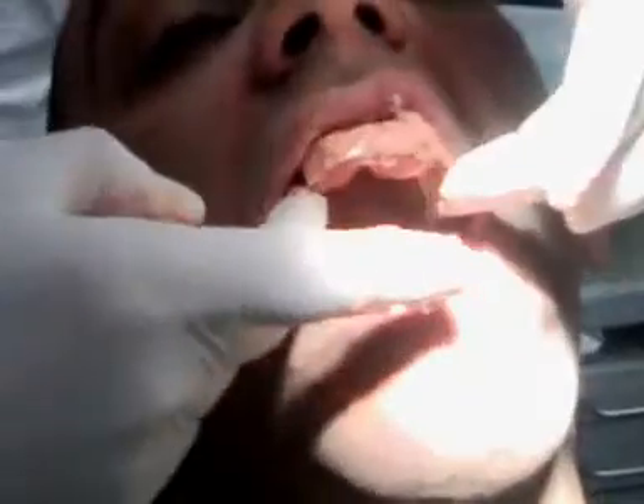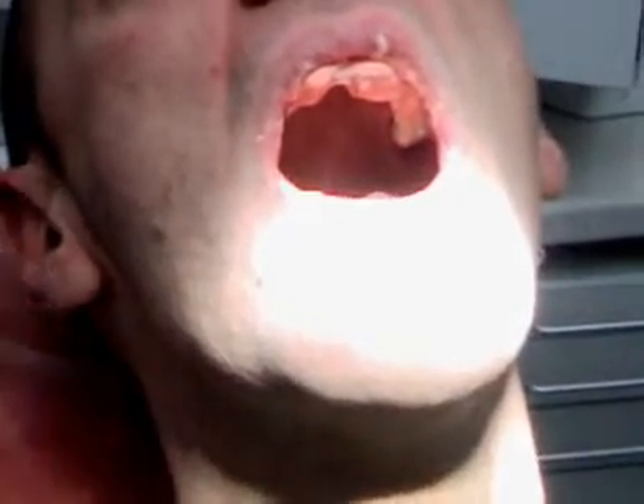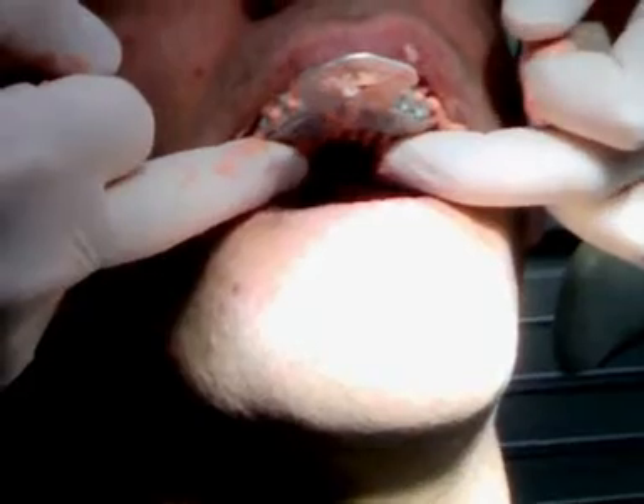Now we're getting ready for an alginate impression. We have already tried the tray in the mouth for exact size. And voilà — now a couple of minutes and as soon as the alginate is finished, it's done. We're going to pull it out of the mouth and we should have our framework inside the tray, ready to go back to the lab and be poured. It's been taken out of the mouth and we can see that the framework is inside.